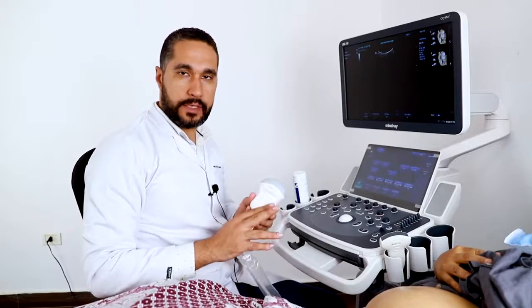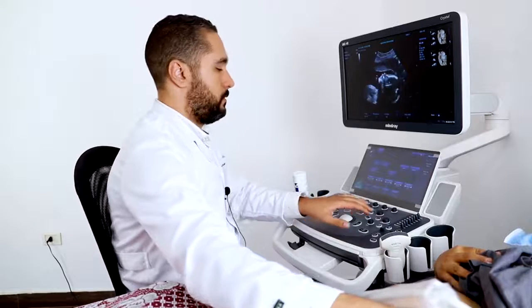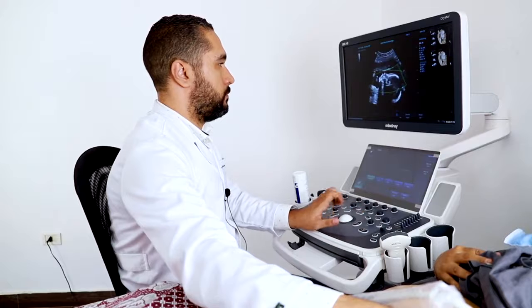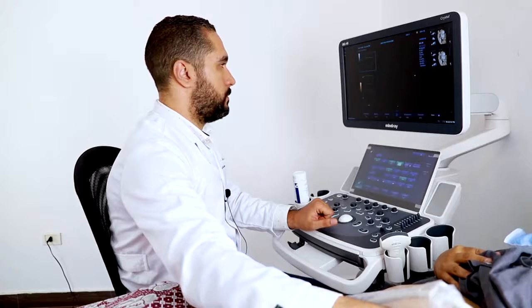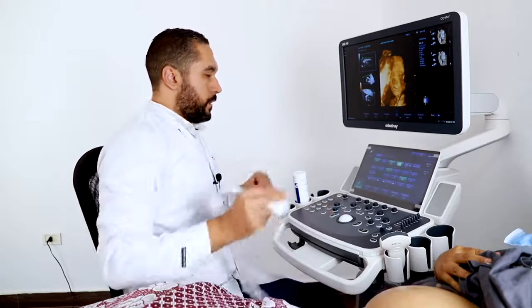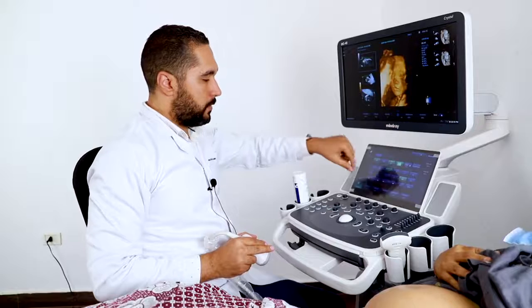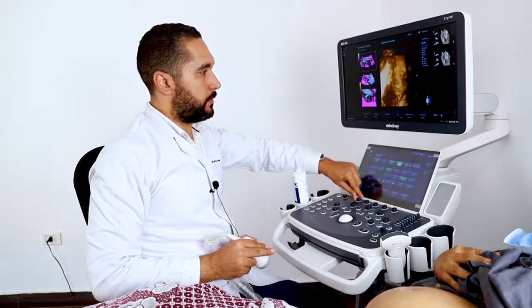Now we're going to do the 3D/4D acquisition with the single 4D probe. This is the surface mode. We can adjust the parameters a little bit to get better details.